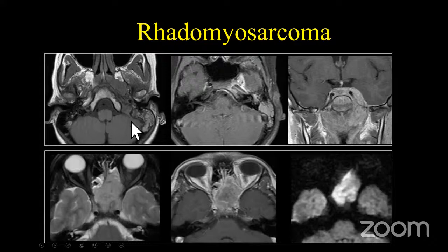If you are an ENT surgeon on this phone call or a skull base surgeon, anytime you have a patient that presents with unilateral serous otitis media and you look at an MR and you see this ipsilateral thickening, you always have to worry about something that's involving the eustachian tube. And remember that the eustachian tube is continuous with the lateral skull base through the protympanum. So anything that compresses that eustachian tube is going to give you that serous otitis media.